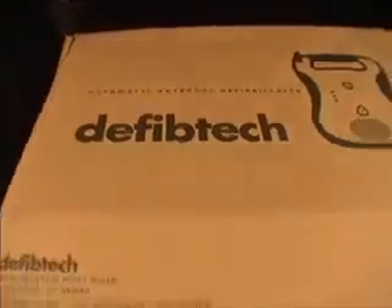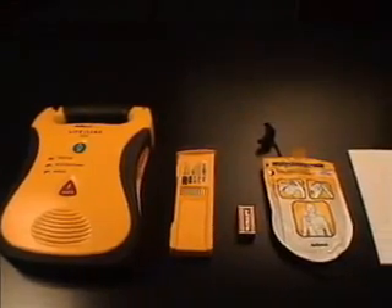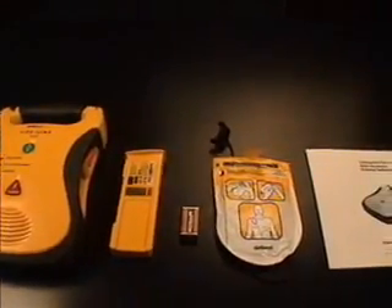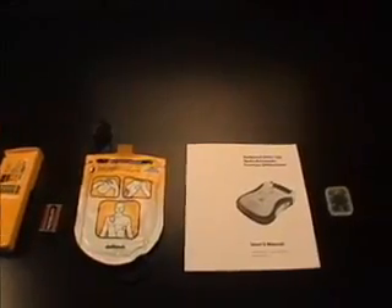The critical components of the Lifeline AED system are: the Lifeline AED, a lithium battery pack, a 9-volt battery, a pad package, a user's manual, and optionally, a data card.